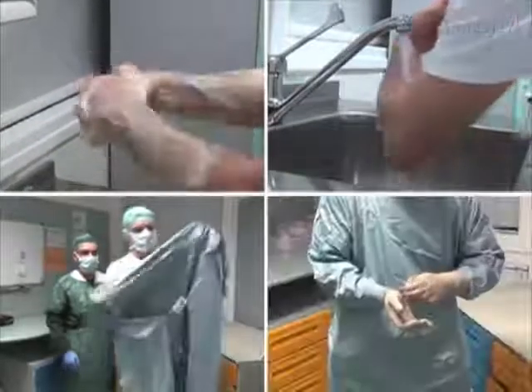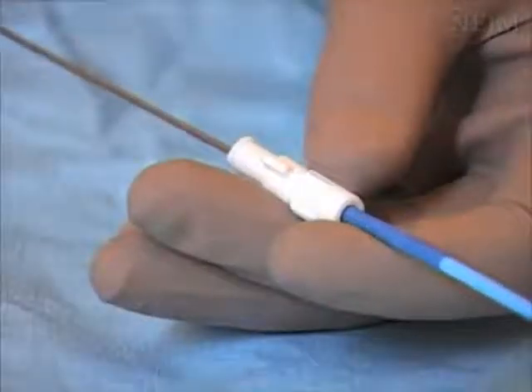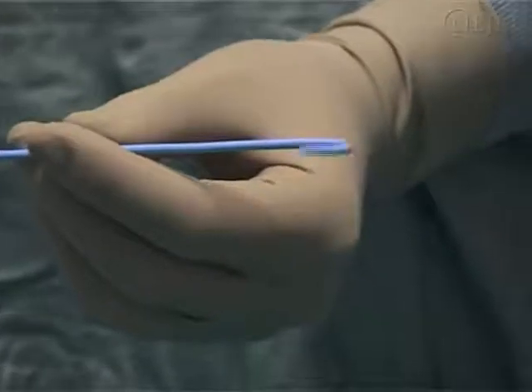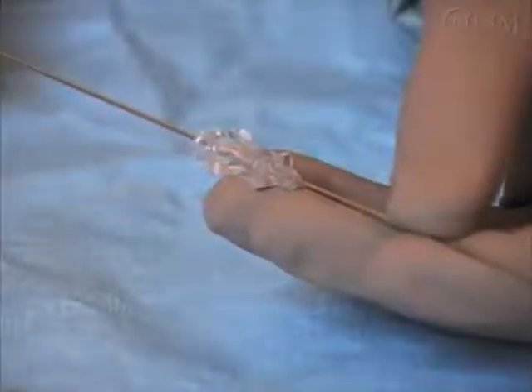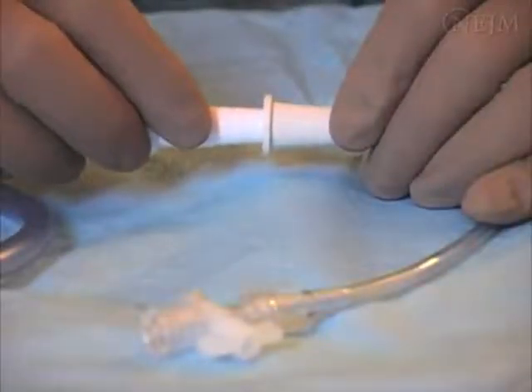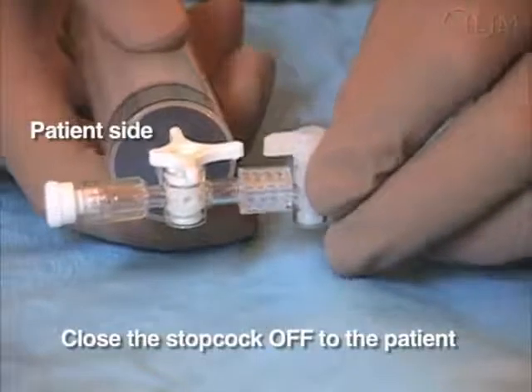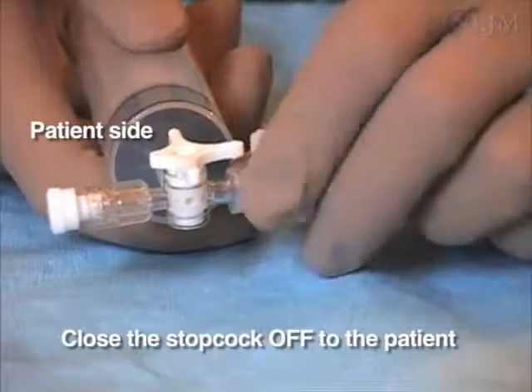Appropriate hand washing is recommended before wearing the sterile gloves and garments. Before starting the procedure, put the cannula into the catheter and straighten it. Then place the stylet into the needle. Next, assemble the drainage system by connecting the drainage bag with the drainage tubing and the tubing to the stopcock. To prevent any aspiration of air, close the stopcock off the patient.